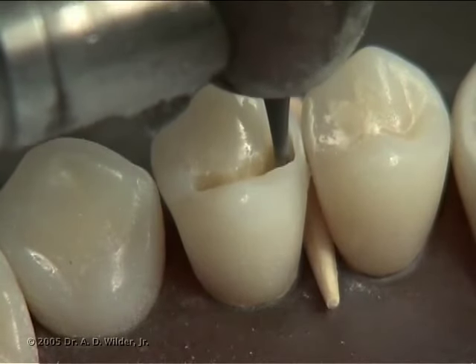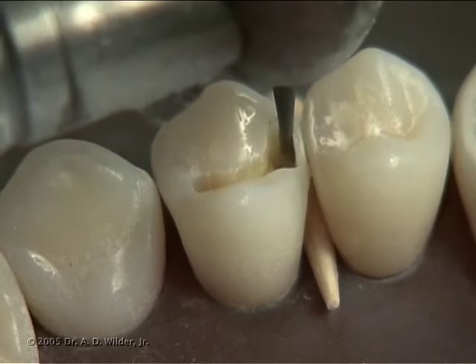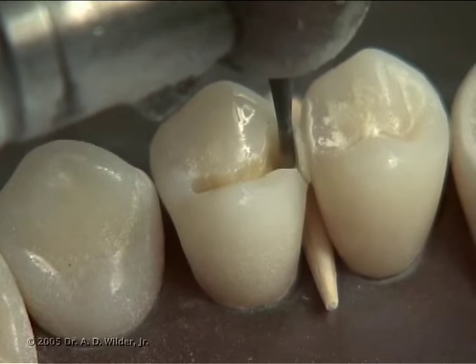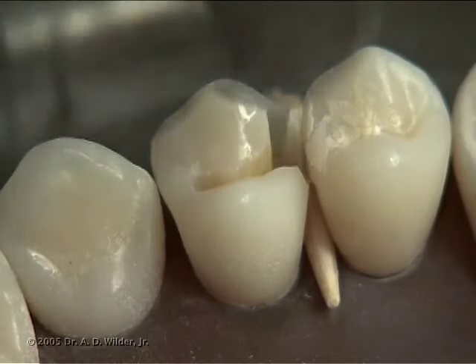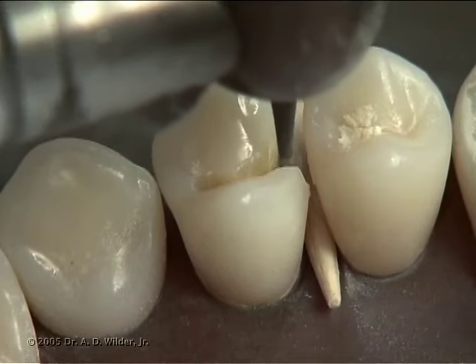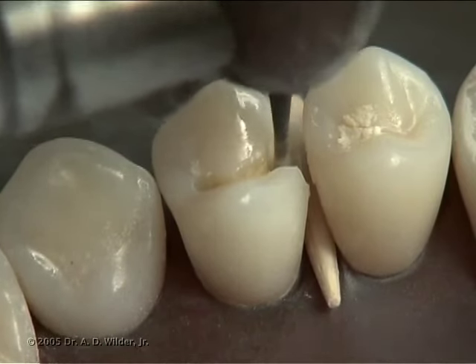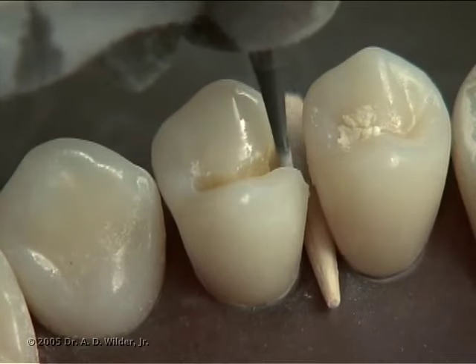Next, we can prepare the proximal box. First, make a ditch cut right along where the enamel meets the dentin and extend the 245 burr to full depth while maintaining a shelf of enamel between your burr and the adjacent tooth. Then gently and carefully move towards the adjacent tooth until you break this enamel free. Return to and refine the proximal box, smoothing both the pulpal floor and axial walls.